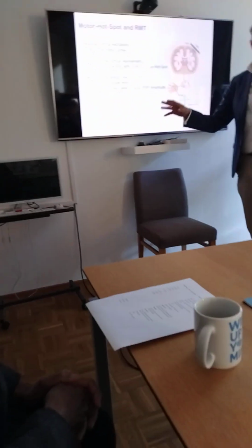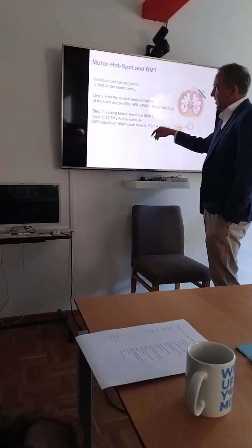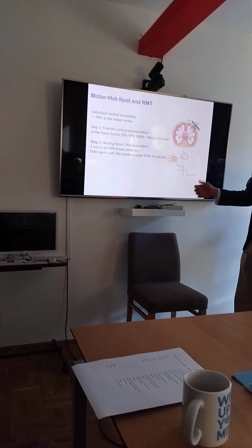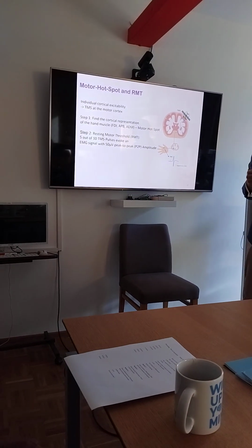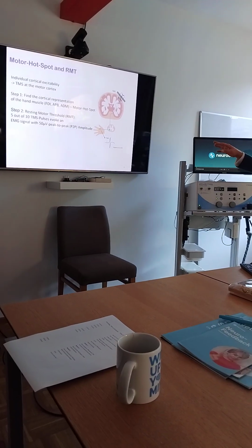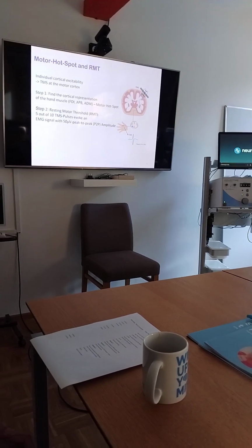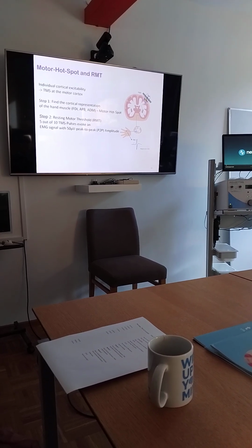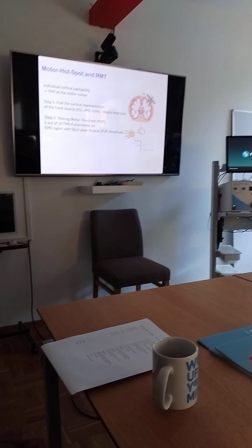A definition which has a broad common sense. To define the resting motor threshold, you need 5 out of 10 or 3 out of 6 TMS pulses which evoke a reaction. Then you have the definition of the motor threshold, but the software itself will make the work way easier for you, so you don't have to bother with this. There is a standardized way to define the motor threshold within the software, and we will have plenty of time playing with it and getting a deep knowledge of how to use it.